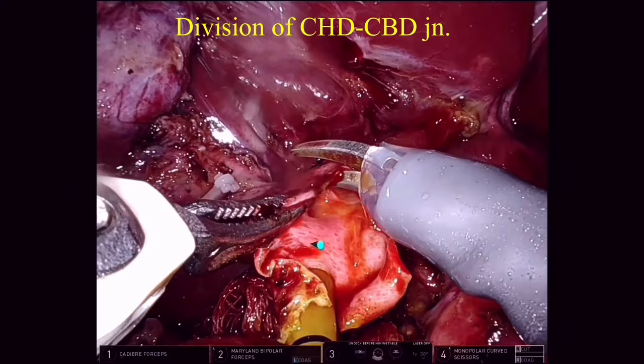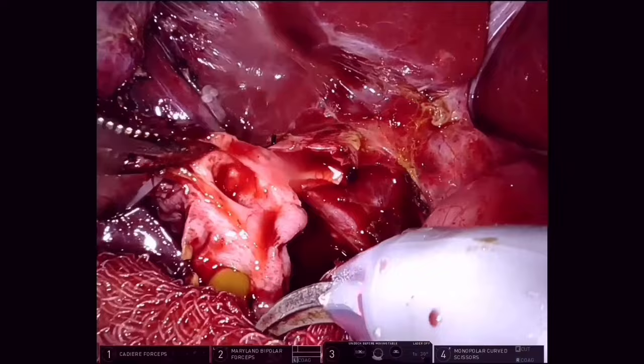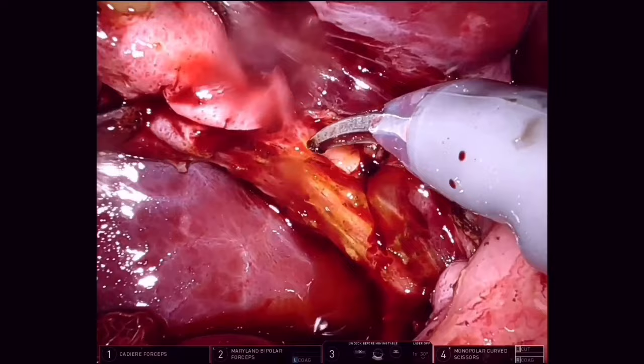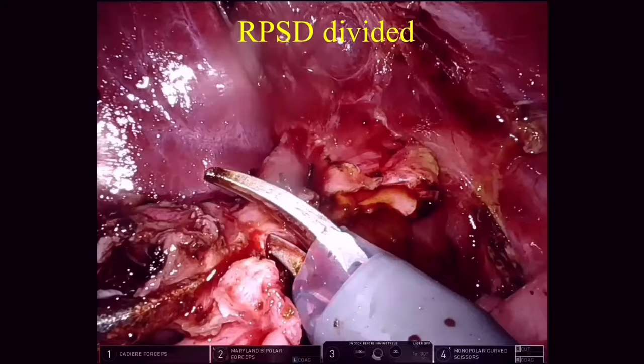The common hepatic duct and common bile duct junction is divided. The opening of the common hepatic duct is isolated. We divide the cystic duct to see better posteriorly, and we see that the aberrant duct is coming down behind the cystic duct and was opening into the distal part of the CBD. We remove the Foley's and the right posterior sectoral duct is now divided at the level of the common hepatic duct.